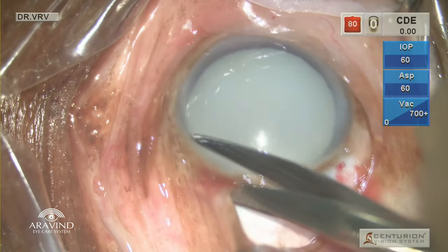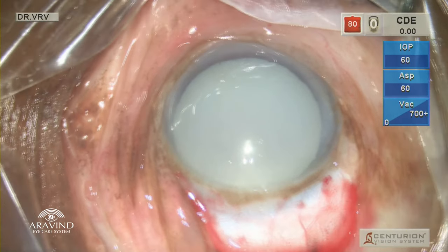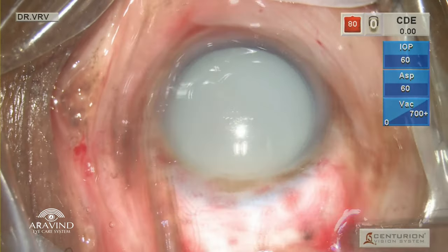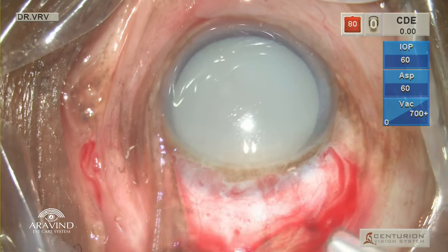tunnel. Once the peritomy is done, since it was a sub-Tenon's block, there was subconjunctival fluid superiorly, which can cause obstruction during the surgery. So using the same peritomy scissors from posteriorly to the limbus, it is squeezed gently and the conjunctiva is drained of the fluid.